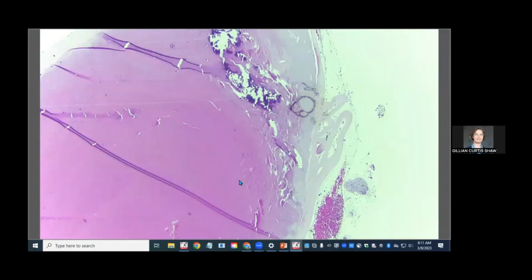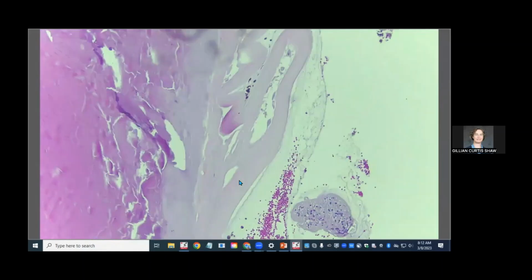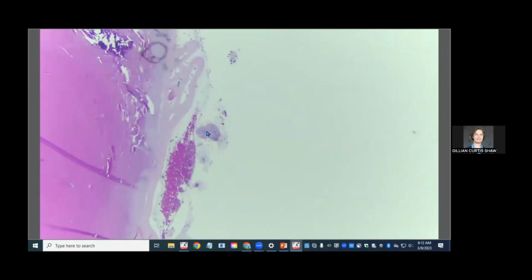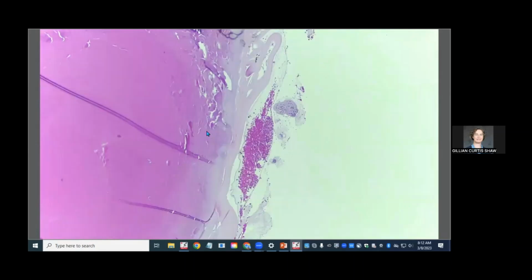So we've got lens capsule wrinkling. And we've got degeneration and liquefaction of the cortical lens fibers. A bit of retina there. Oh, sorry, little ball of retina right here. And then there's some of that mineral that we looked at lower mag. So this is a hypermature cataract. This posterior lens capsule, let me check here.